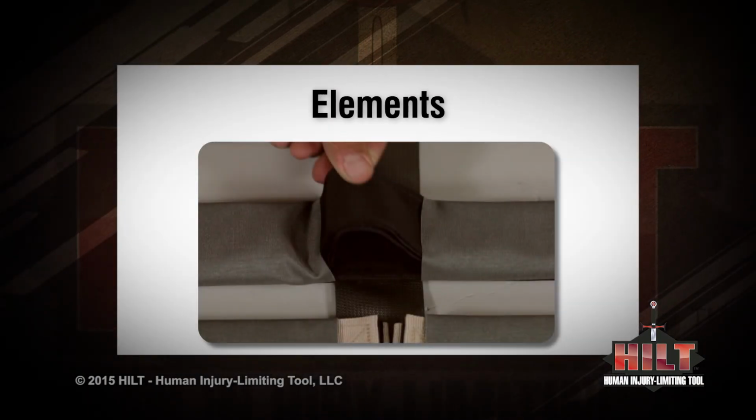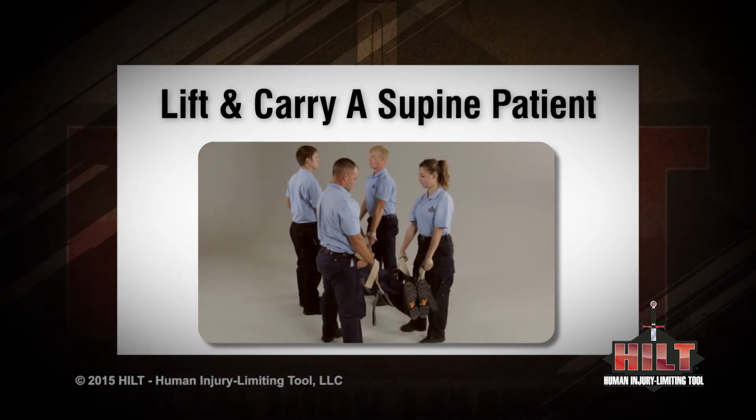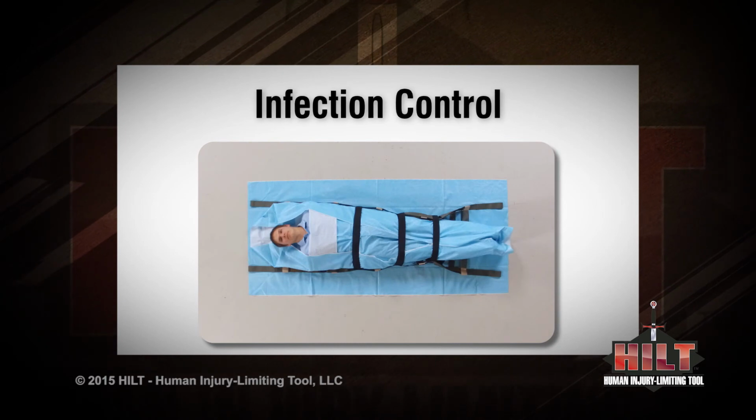Be sure to view the elements, lift and carry a supine patient, and infection control videos for additional information.